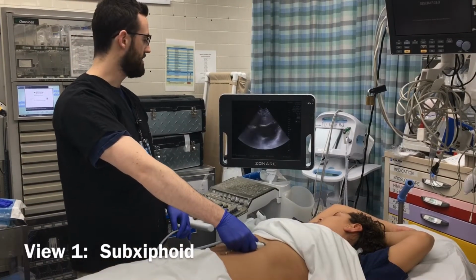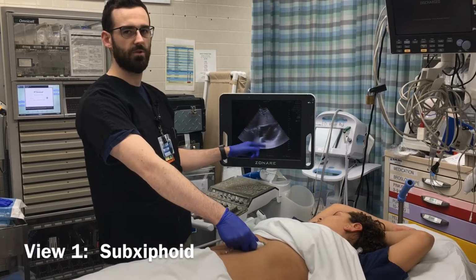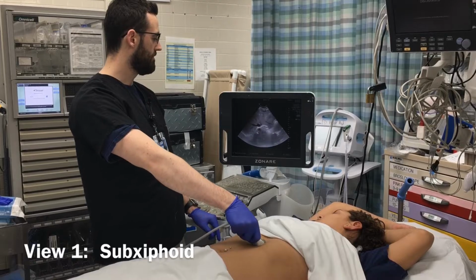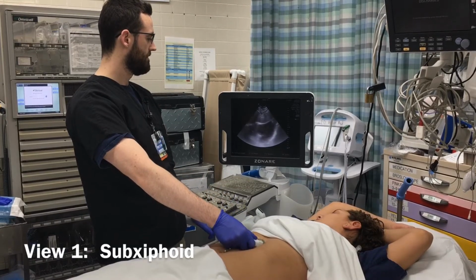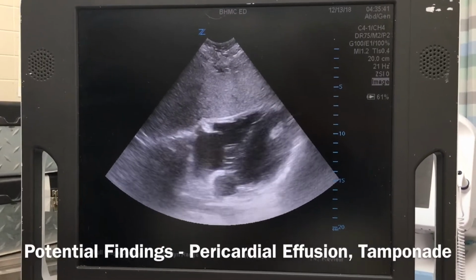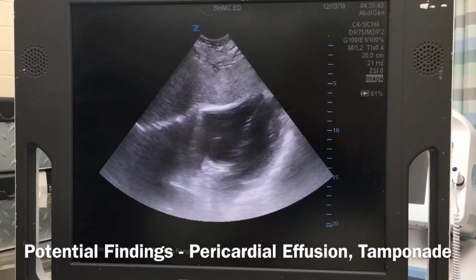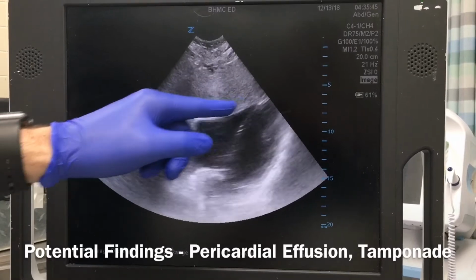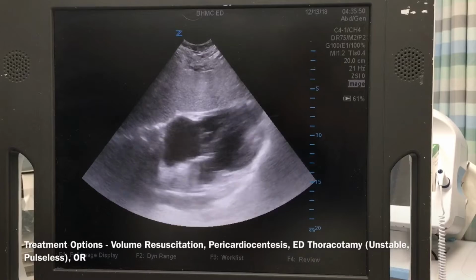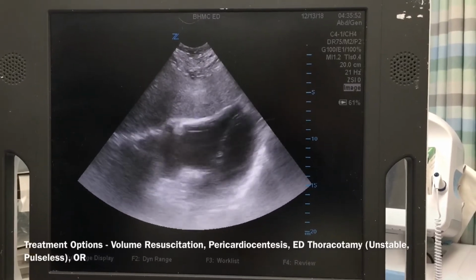And what you're going to do is push down, and you're going to make sure that you see all four chambers of the heart with the liver in view. And then you're going to sweep through. So what we want to look for is all four chambers of the heart with interface with the liver, and the most important area is right between the liver and the right ventricle, and you're looking for free fluid. And you want to scan through, and in this case we don't see any free fluid.